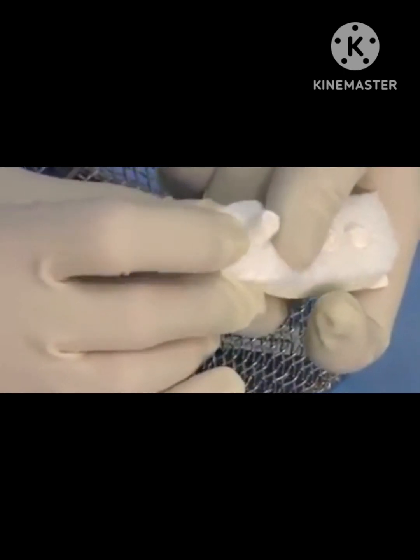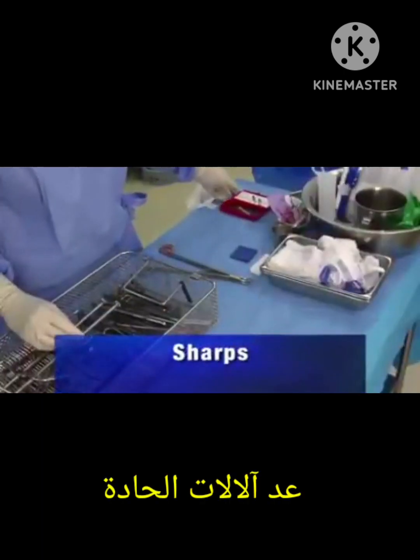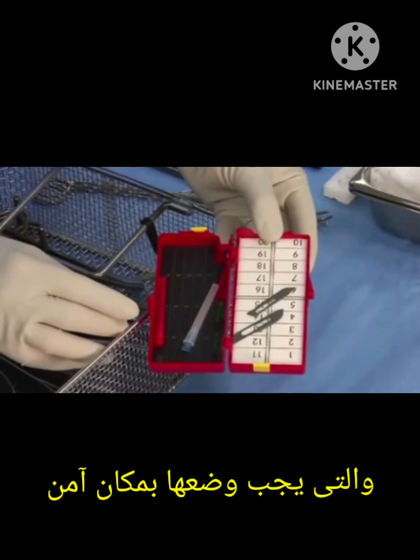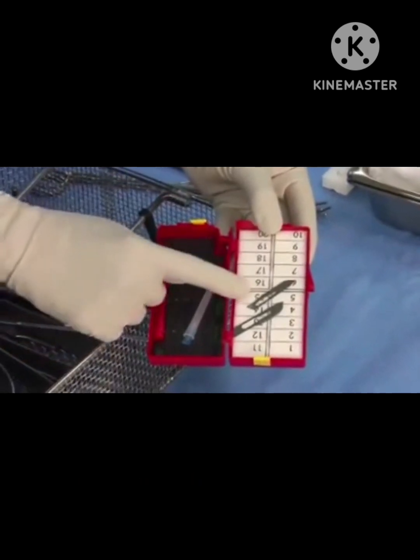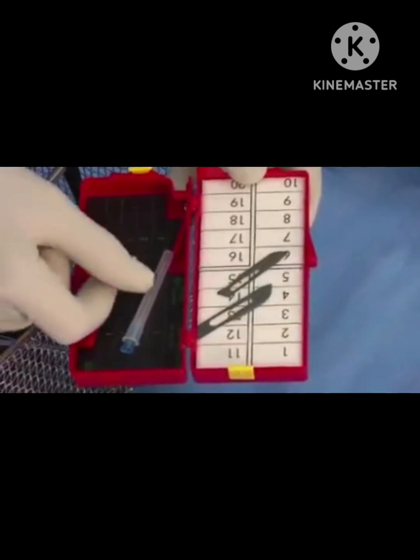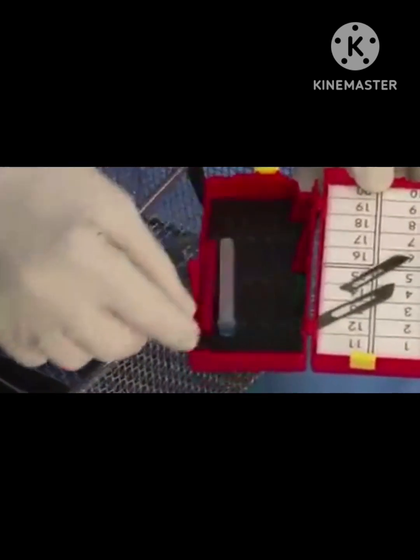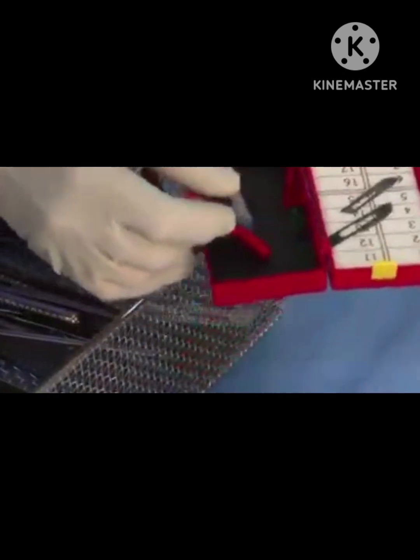The scrub nurse pops them up or indicates them so that the circulating nurse can visualize the sponge and the radio-opaque strip. After counting, place the sponges where they will be used. Count sharps next. Scalpel blades are placed into a safety container to prevent injury or loss on the back table. Do not pick up or handle the blades to count them — indicate each blade separately as you count.